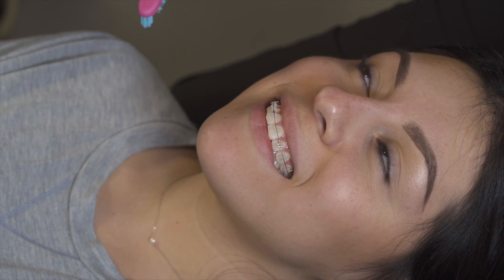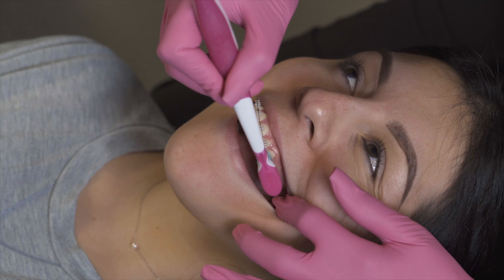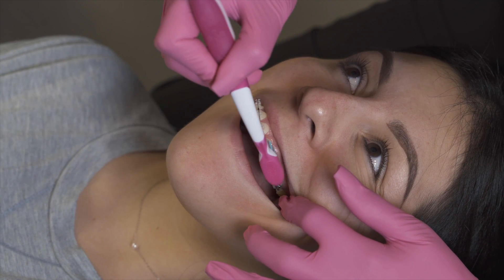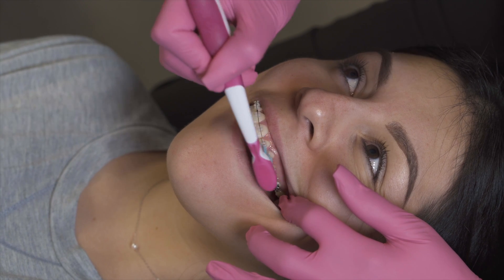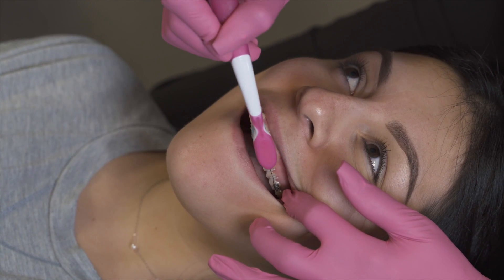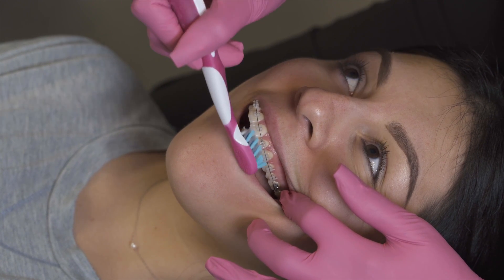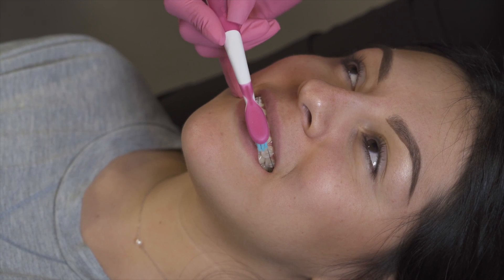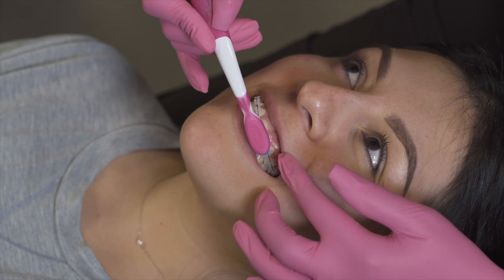So we are going to show you how to brush the proper way with braces. When you're brushing you got to make sure that you do circular motion — you are rotating the toothbrush in a circular motion. You're brushing really good around the gum line, making sure you go above the brackets, in between the bracket, and underneath the bracket. You should not be brushing side to side like you would normally because you're missing the top of the gum line.